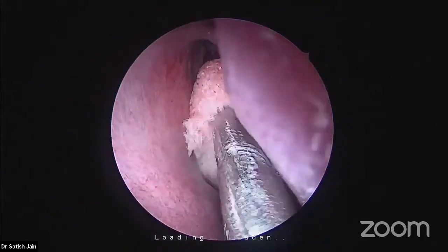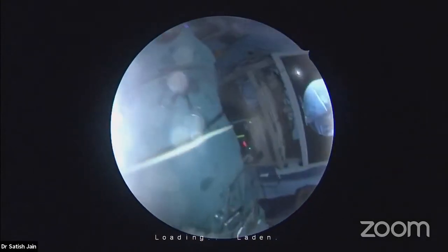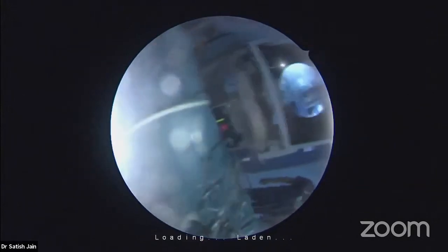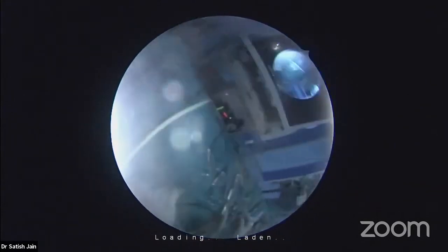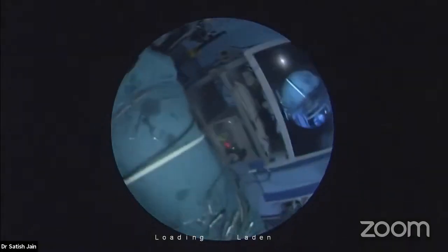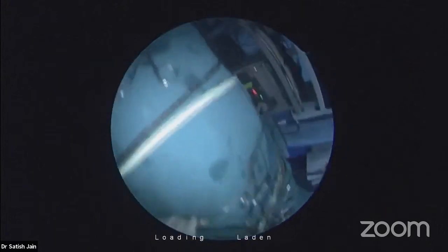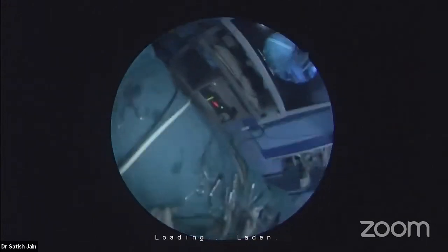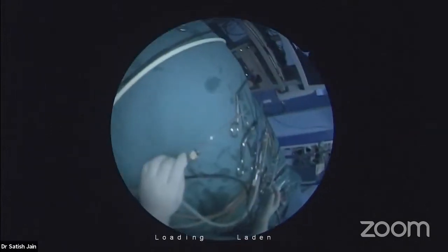The size of the antrostomy is now related to the demand of topical steroid post-operatively. For example, in a patient with a massive eosinophilic profile, I would like to create a mega antrostomy to deliver more and more topical steroid. In a patient with more massive fungal disease, I would like to create an even more massive mega antrostomy for lifetime surveillance, lifetime irrigation, more steroid going in. All are purposes for a mega antrostomy.